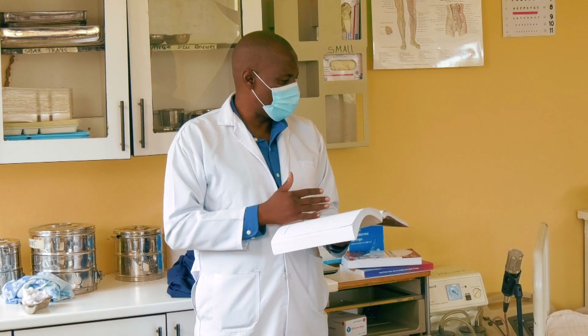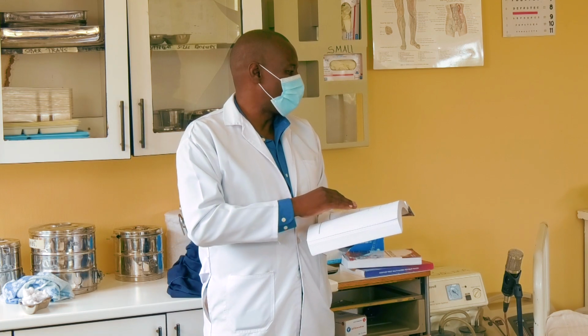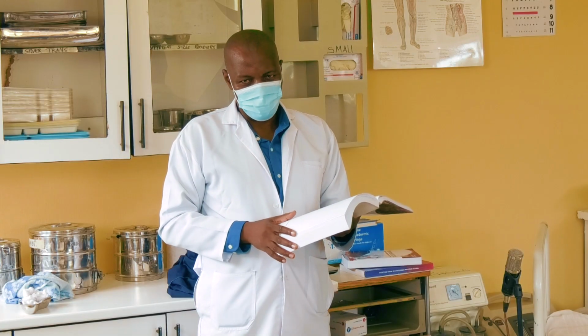I'm sure when you're doing any procedure, you talk to the patient and tell them, don't worry, I will do this, privacy, whatever you talk about. The other thing: do not overexpose the patient, okay?